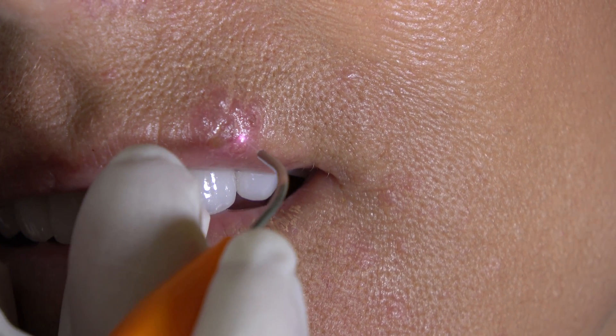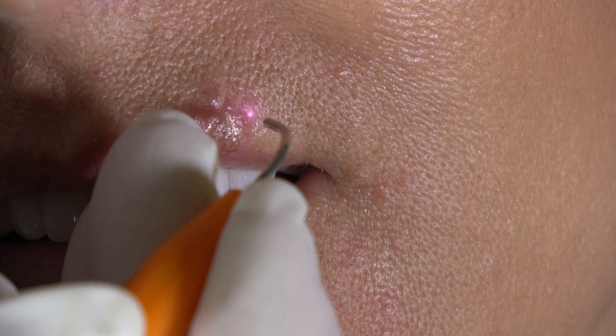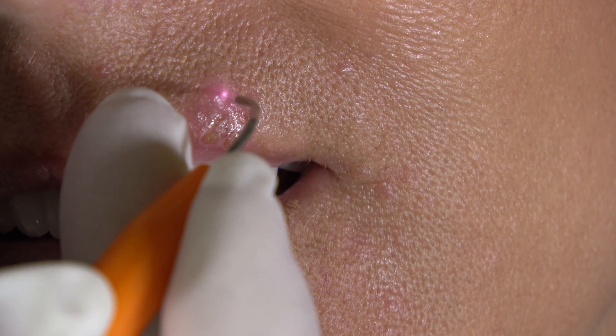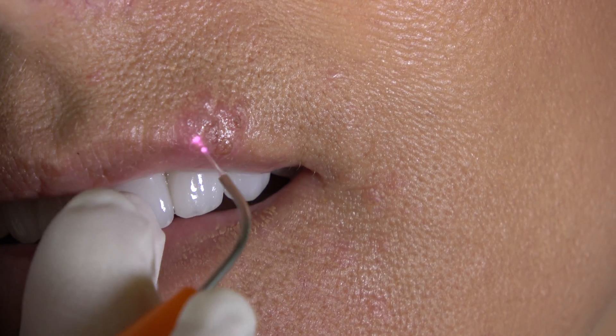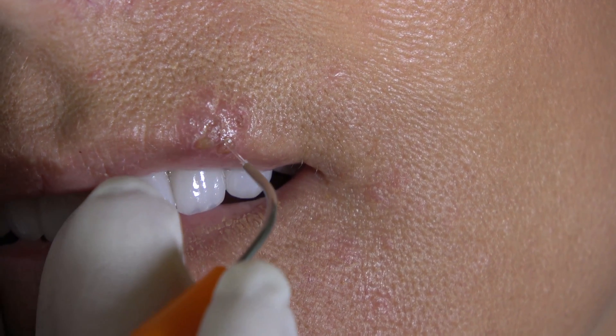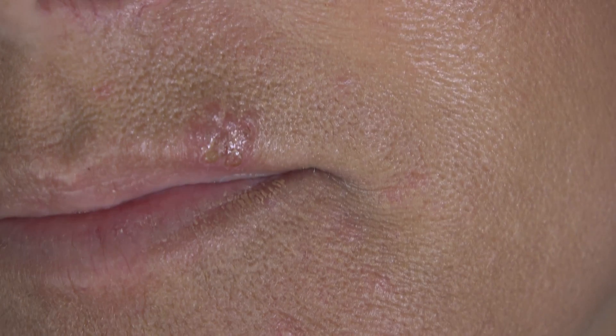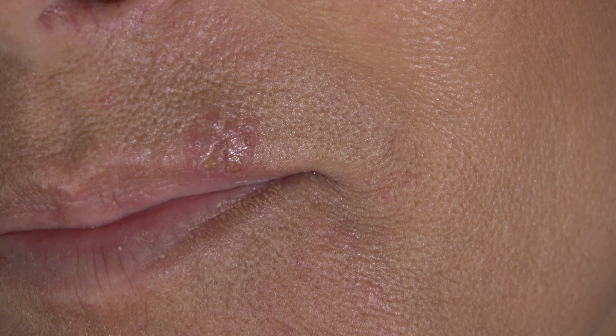If I can touch the lesion itself, I will. My goal is to get as close as possible without it being too uncomfortable for her. We're going to bump it up again another tenth of a watt — I'm at 0.7.